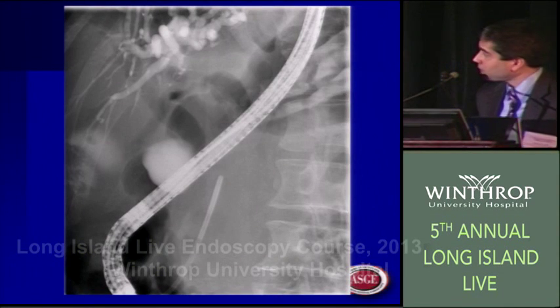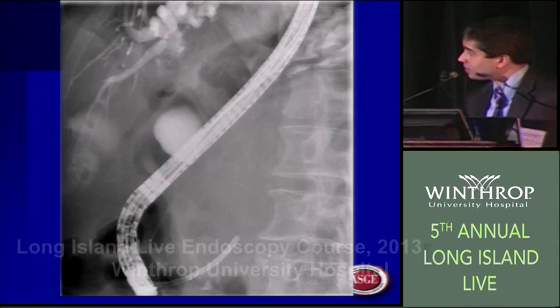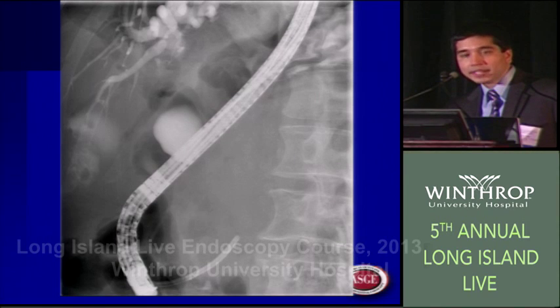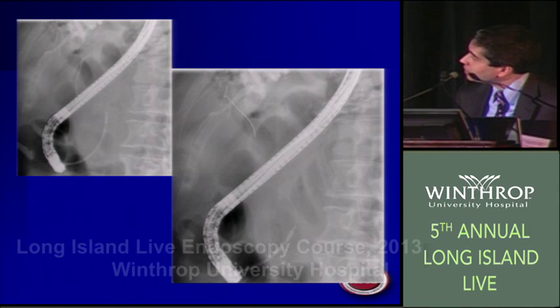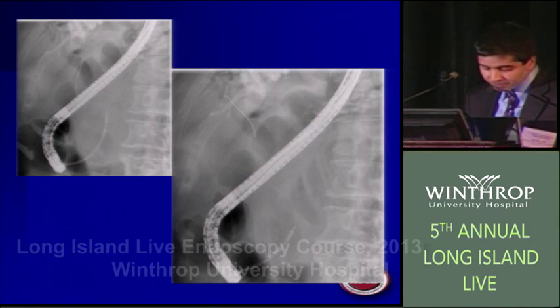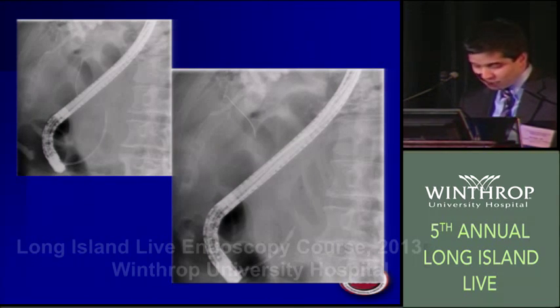This is the SPY catheter at the upper margin of where I saw the villous lesion on the bile duct side. And this is the lower margin, again marking it with cholangioscopy guidance, the villous lesion both proximal and distal. It's not a stricture we're dealing with, but more a villous mass. So I applied RFA on one occasion, with multiple stents. This is the catheter, and you can see the radiopaque marks that mark the upper and lower margin of the treatment zone. I applied it and overlapped it. Usually we do 10 watts for about 90 seconds, in the upper margin and then overlapping the lower margin.